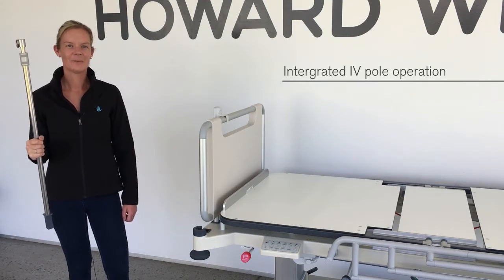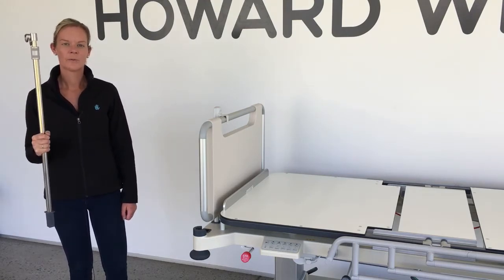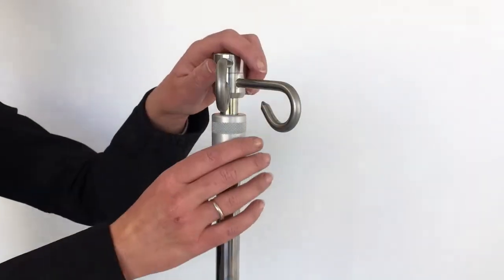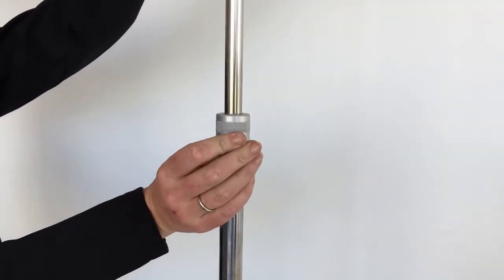A two or four hook IV pole is available. Plug the IV pole into one of the bed's four corner sockets. To extend the IV pole, loosen the locking collar and move the hooks to the desired height, then tighten the collar.